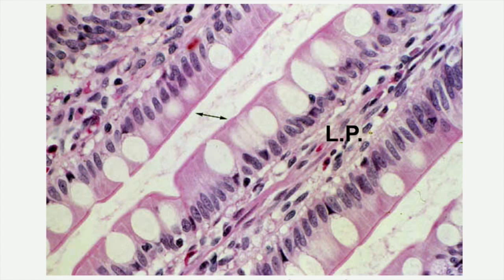And they have a specific name which is brush border, like the hairs of a brush. These cells are tall columnar with basal oval nucleus, and you have to remember also, in addition to the light microscope picture, the EM picture.